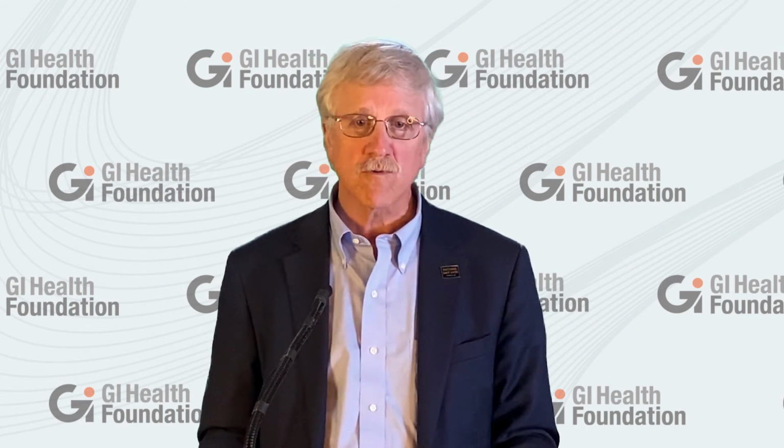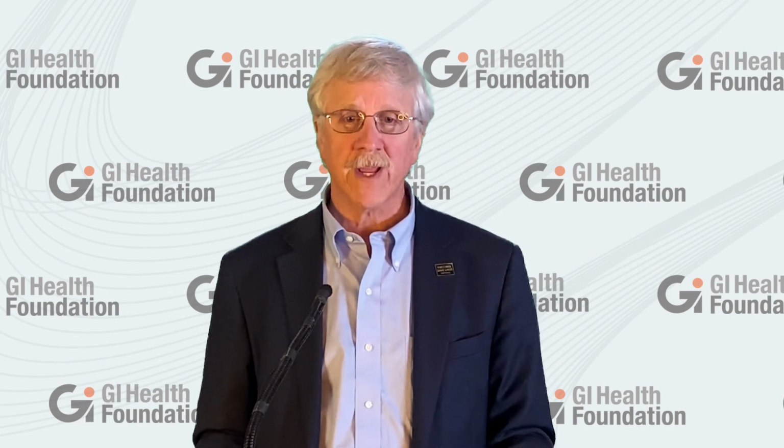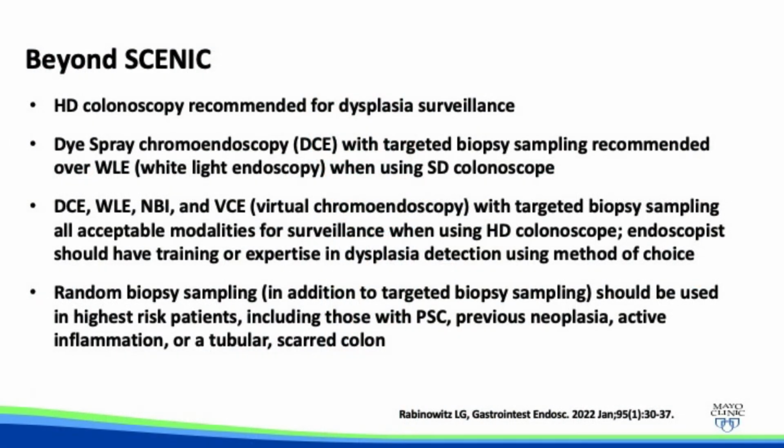And you have a number of different techniques. Dye-based chromoendoscopy, white light endoscopy, NBI, and virtual chromoendoscopy with targeted biopsy are all acceptable modalities for surveillance when using high-definition colonoscopes. And the endoscopist should have training or expertise in the method they're using. Random biopsies still should be obtained in addition to targeted biopsies in highest risk individuals, those that have PSC, previous neoplasia, active inflammation where you really can't use virtual chromoendoscopy or dye-based chromoendoscopy, and those with a scarred tubular colon.